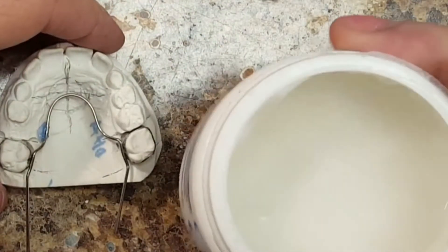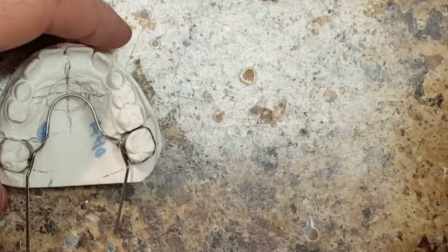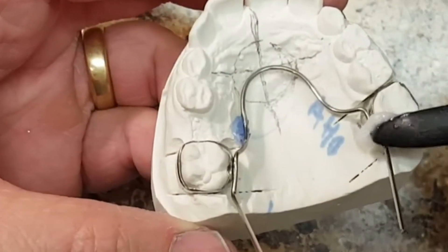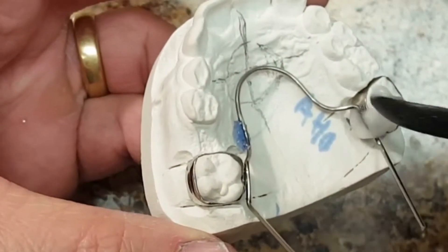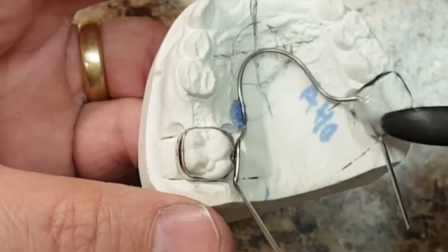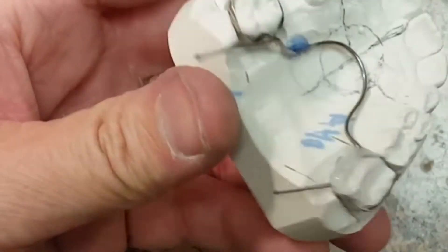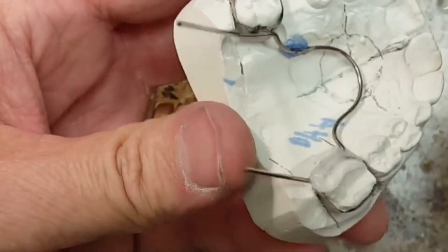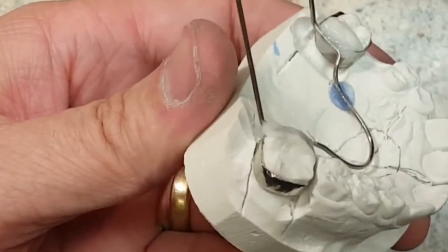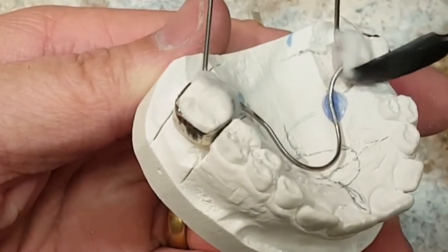I use a very liquidy flux. To begin with, I add my flux to my wires. The Nance button wires have been spot welded with the spot welder to give extra adherence. I like the flux to be nice and creamy. You can do this by adding water.